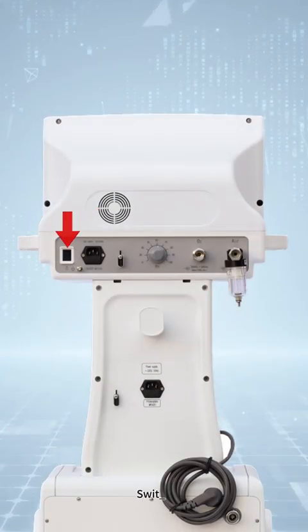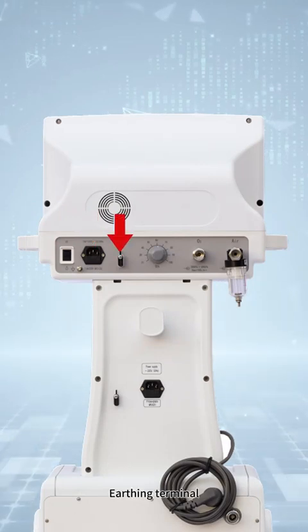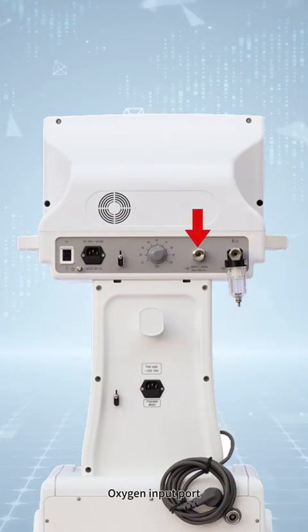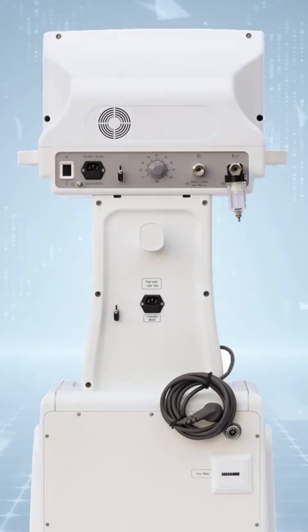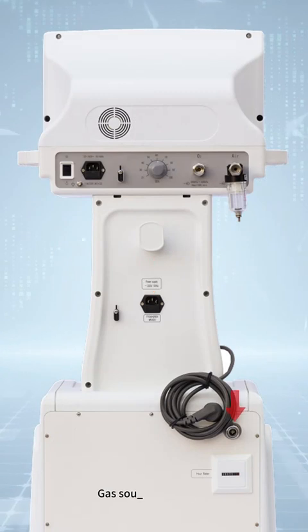Fan. Switch. Power socket. Earthing terminal. Oxygen concentration adjust knob. Oxygen input port. Air input port. Earthing terminal. Air compressor power socket. Gas source outlet port. Hour meter.